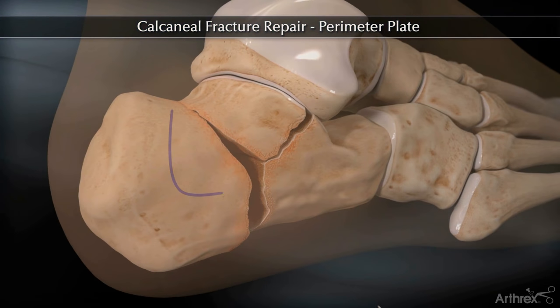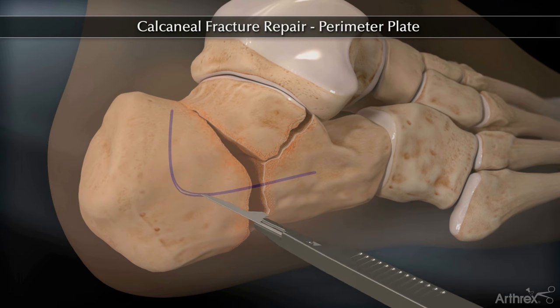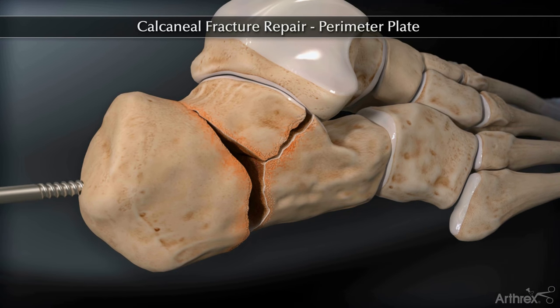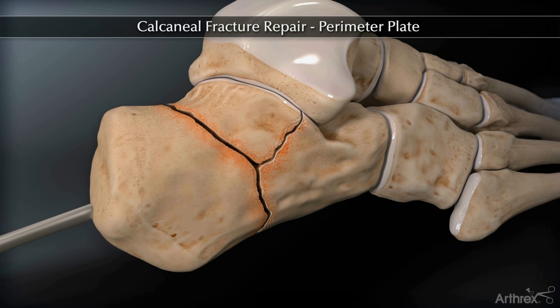An extensile, L-shaped incision is utilized for exposure. Insert the 5.0 mm Shantz pin into the calcaneal tuberosity. This may be placed posterior or lateral. Reduce the fracture using the Shantz pin and the calcaneal-specific elevators.